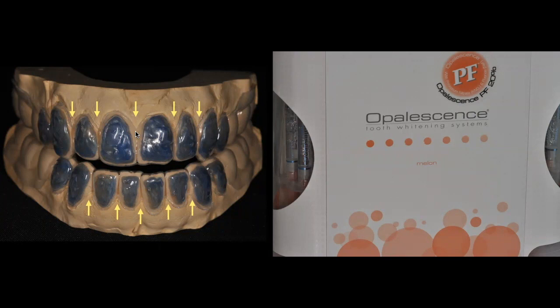But again, in this particular case, because I did not want this patient to have any gingival irritation, and because of his thin biotype, I decided to do a very thin layer of a reservoir on my cast and then be able to dispense this to the patient. In this particular case, I taught the patient in my office exactly how much product he needed to dispense, how to put the trays in. If I deliver the tray in my office, I always tell the patient I want them to use the tray at least for 2 to 3 hours. And if possible more, that's okay.